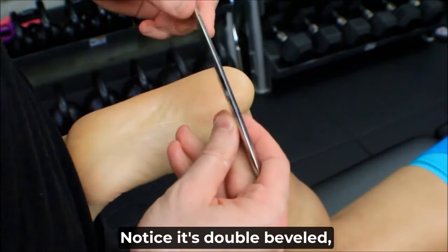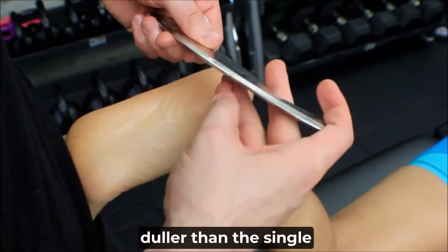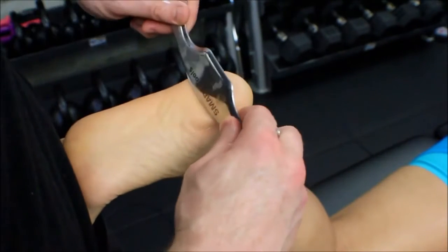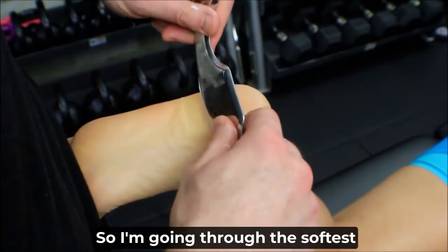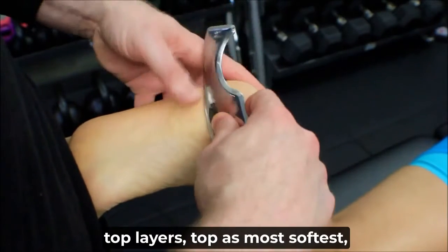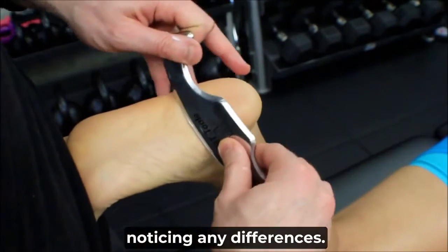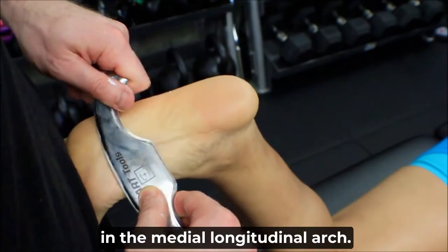Notice it's double beveled, which means each side has been sanded down, and these are just a little duller than the single beveled ones. All right, so what I'm going to do is just pull through the tissue, noticing any differences. You guys see how I push in till I get a little kickback from the tissue. So I'm going through the softest, most superficial layers, and then just dragging through. Noticing any differences, and I definitely notice a little bit of difference here in the medial longitudinal arch.